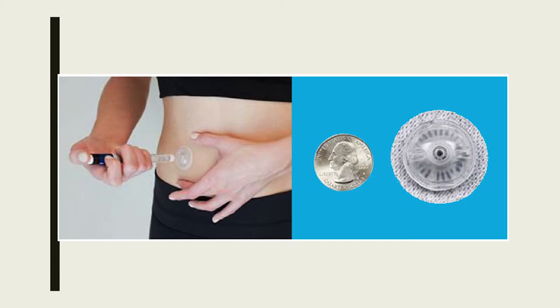So when you go into the hospital, you have an IV so that all your injections go through it, and you don't get stuck each time. And this is functioning in a very similar manner. You replace it every 3 days, because it uses insulin pump technology. So this looks exactly like my insulin pump site, with the exception that they've modified this a little bit to allow for injections. And so there's a lot of novel things in diabetes.